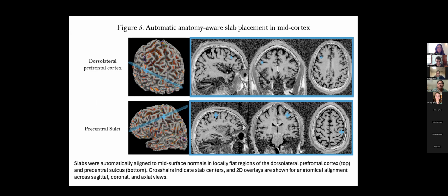There is one important point that I didn't mention. It's not in the images, but more in the write-up. All of these high resolution scans also use VNAVs, the navigators. So there is good motion correction built in to at least some of the results that we acquired for the 220 micron and everything. So I think that's also why they look nice and crisp rather than blurry. Yeah.